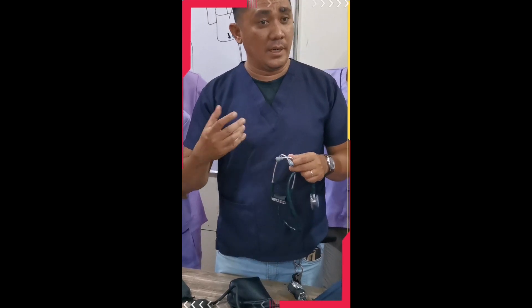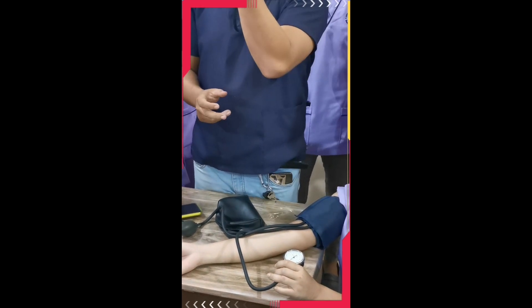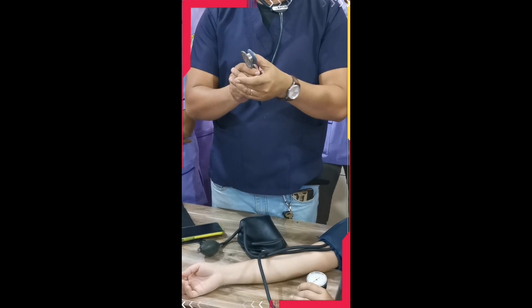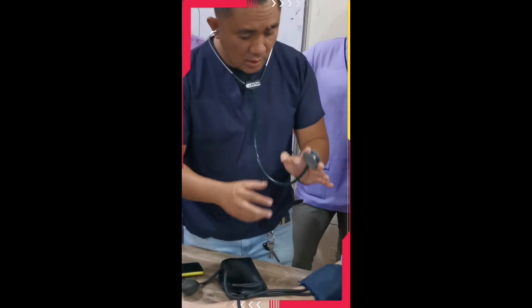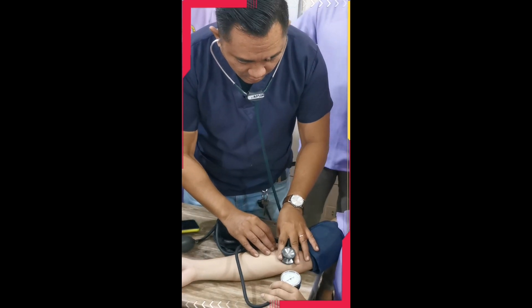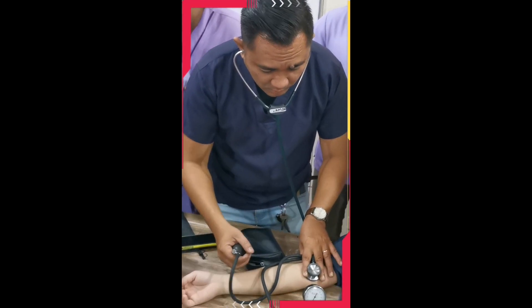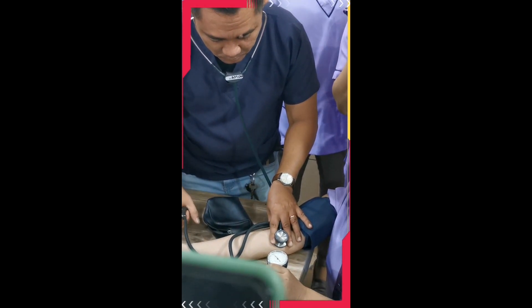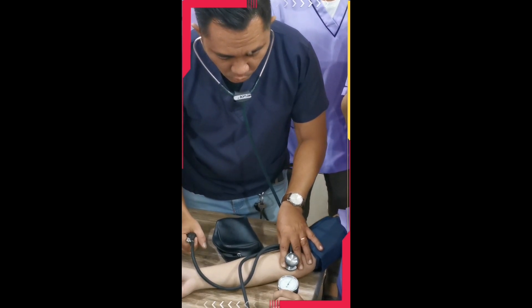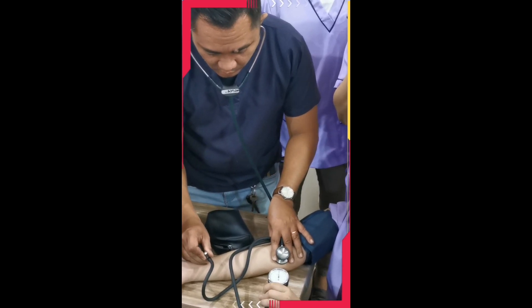Now let's go through taking the BP of your patient. When holding the diaphragm, remember your thumb also has a pulsating force — that's why doctors hold the diaphragm with their fingers, not their thumb. Place the diaphragm on the brachial artery where you located it. Make sure the air release valve is locked. Then inflate — we will go with 160. Once we reach 160, hold the air release valve fully, then slowly release.